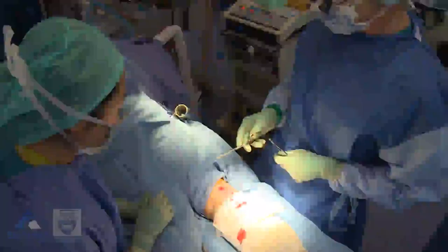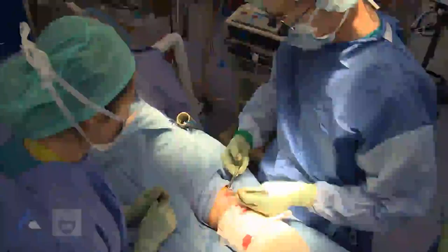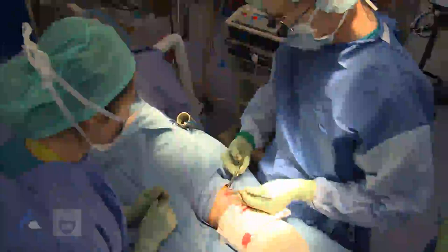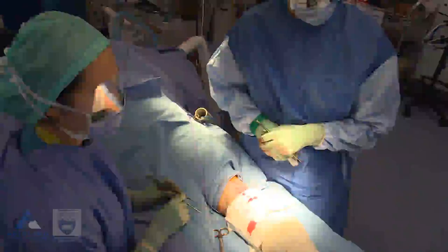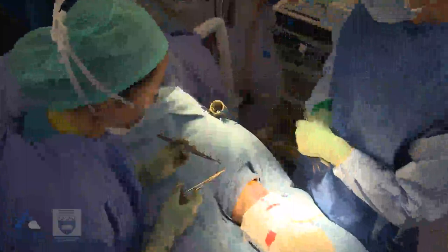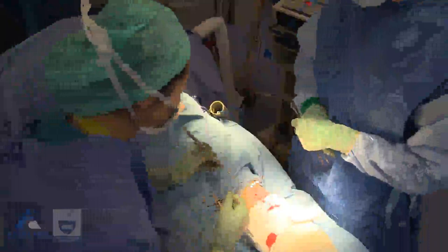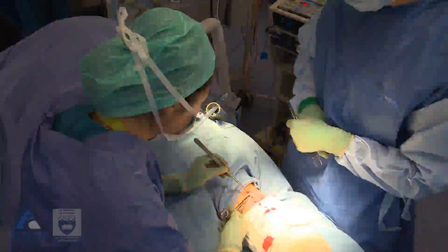Then you take your first bite through deep tissue — one side — the other side through deep tissue as well. Come back and you load it in a reverse fashion. Then you come back through on the same side to take a superficial bite — I'll just talk out loud for this. Stop me if I'm doing anything wrong, and you'll just talk through the six steps.